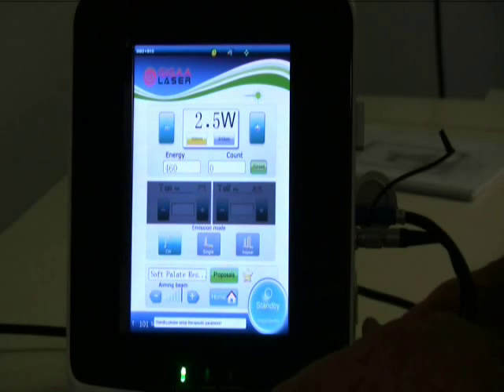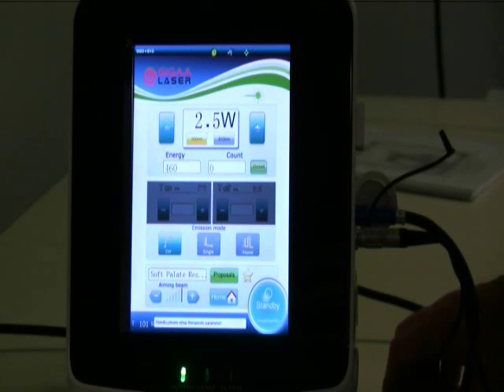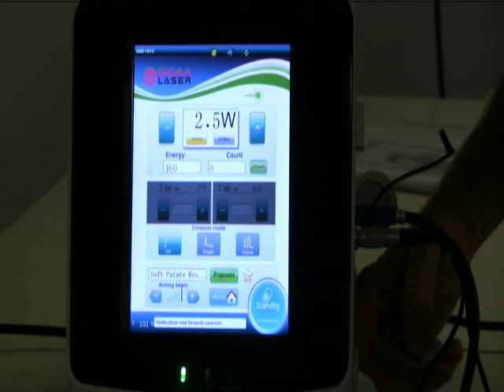The surgical one, I'll warn you, takes a little bit more time to get yourself organised and learn how to do it. It takes a little bit of skill, not as much as ultrasounding, but it does take a little bit of skill. The therapy, on the other hand, is basically a no-brainer. Anyone can do it with very limited knowledge.